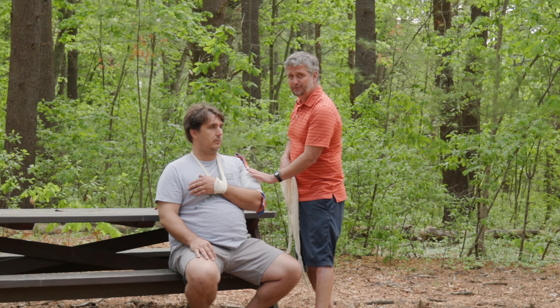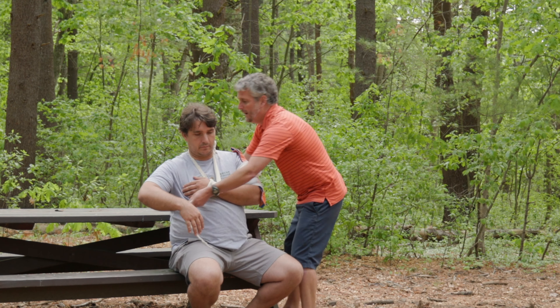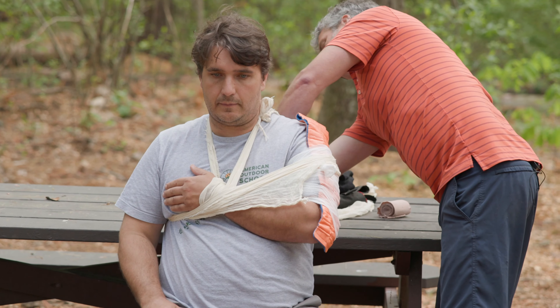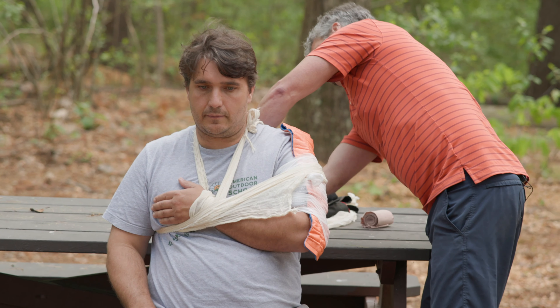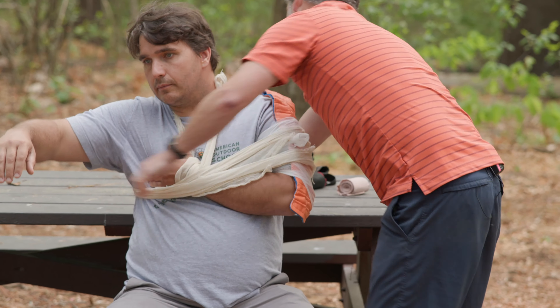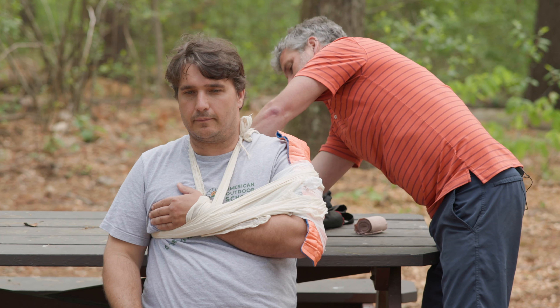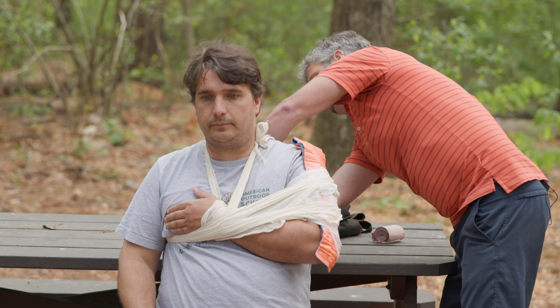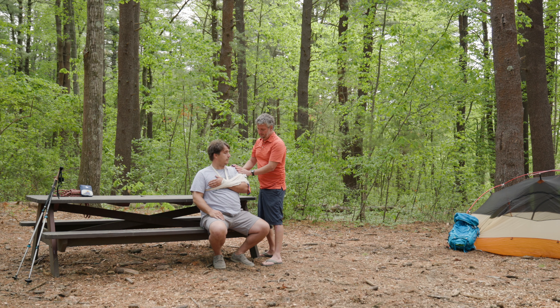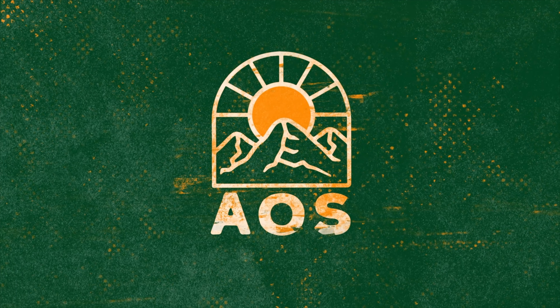I still want to support this arm because it can flop around, so I'm going to build my swaths. You have to be careful going across the broken arm, so make sure you go around and are aware of where the break is. Simple tie in the back. Asking your patient if they can breathe — wonderful. I now have a secure upper arm splint.